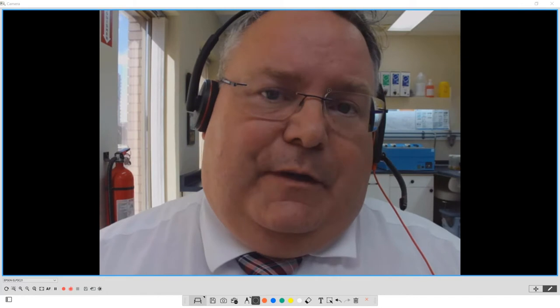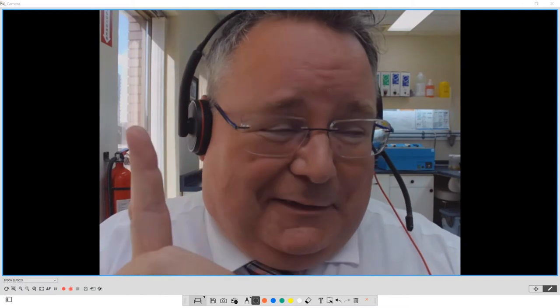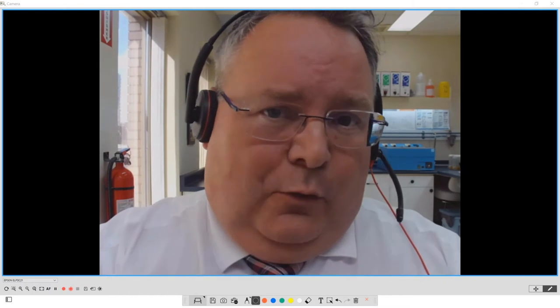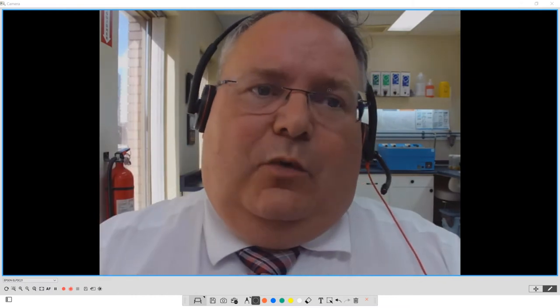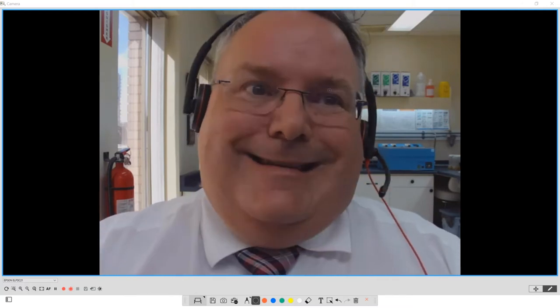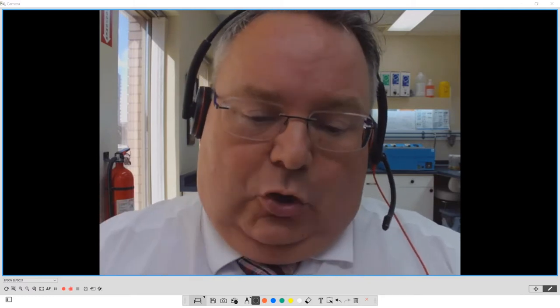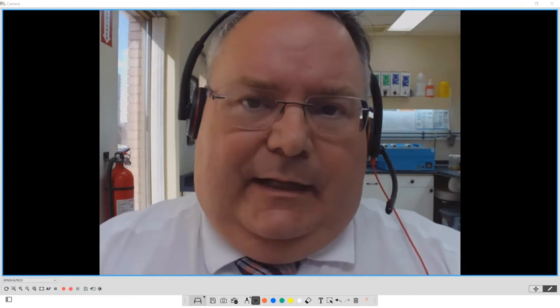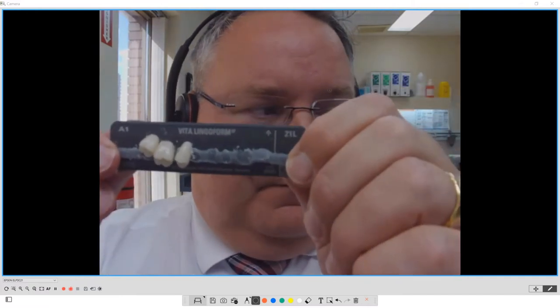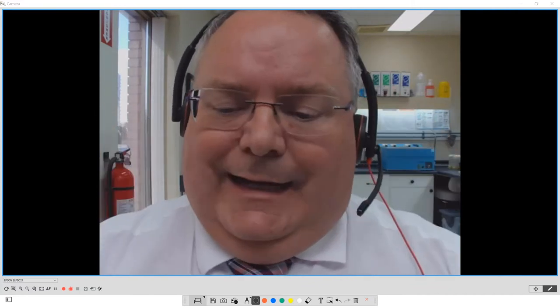Now the system functions for the patient. I check anterior. Again, I'm getting better as I get a little older, to watch jaw movement, and then I make a couple little notes for the case of how much overbite and overjet I'm setting. It's never 1-to-1 or 2-to-2. It's all over the map for me based on what I think that patient is and needs from me. This is about me trying to be a superhero for them. I'm following some rules, but I'm also manipulating things, and I'm using a product that can manipulate and let me work, and be flexible, because I need it to be flexible.